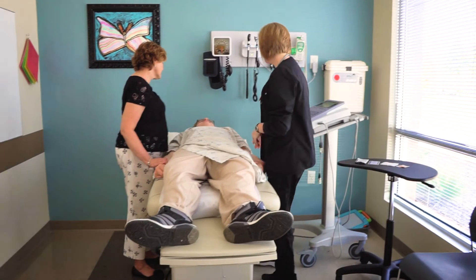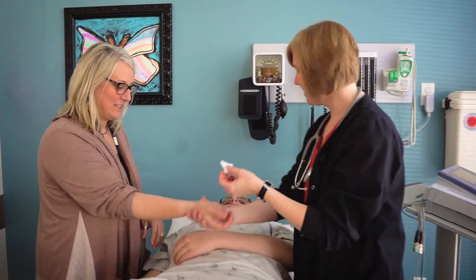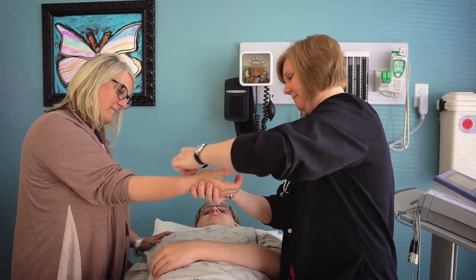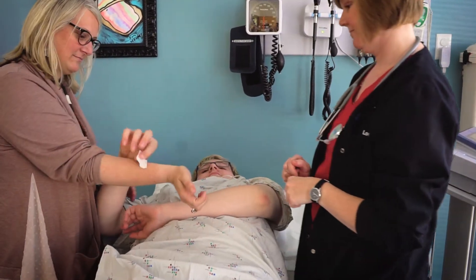Hi Max, my name is Lori and we're going to do an EKG today. As a healthcare professional, it is important to remember that when you are working with patients with autism, to strive to begin and end the appointment on a positive note. A few things to consider during an EKG appointment.